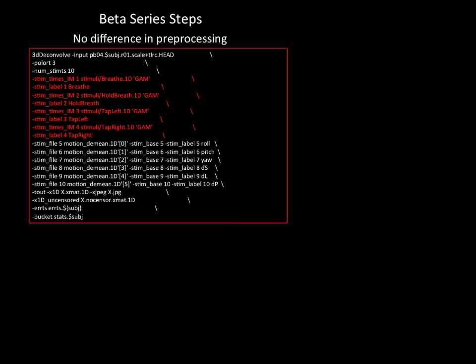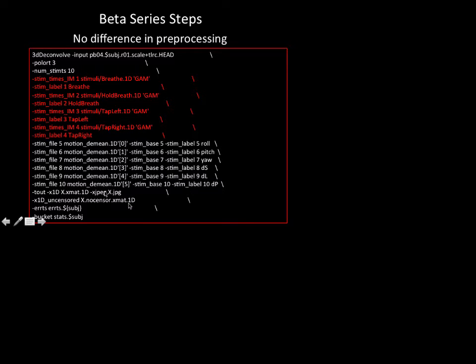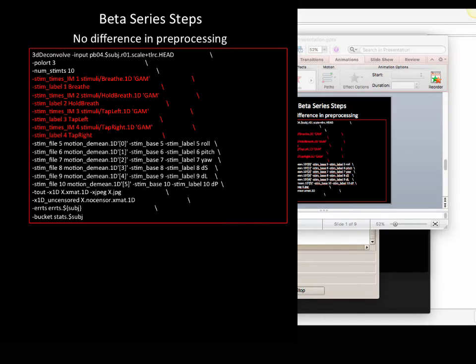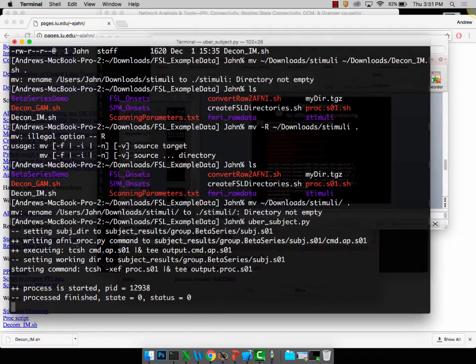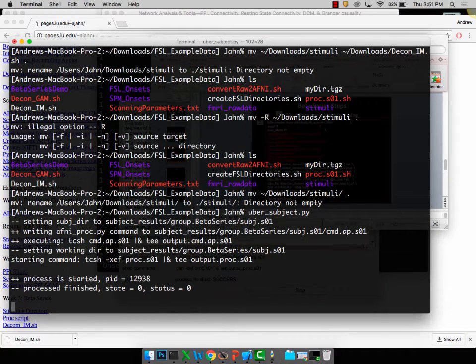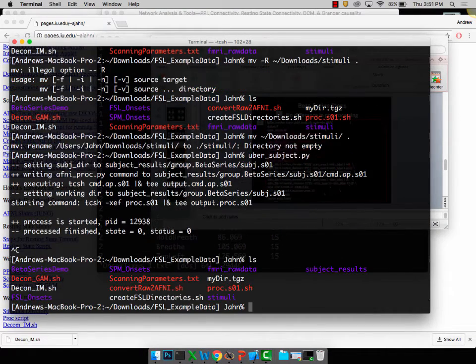Let's take a look at what this looks like. If you've been running it, it should be done by about now. Let's check on that, make sure it's okay. What should have happened, if we go into subject results, so one, just keep spidering down until you get to the very last directory.